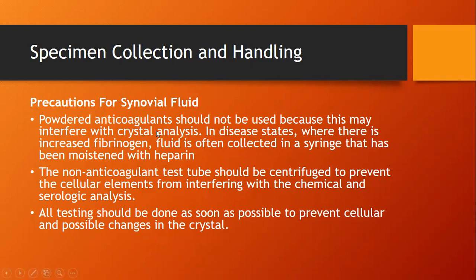Okay, so remember, when we do synovial fluid analysis, there's a parameter where we check for any crystals seen in the fluid. And if we use powdered anticoagulants, chances are you get artifacts that might be mistaken as crystals. Okay? That's why we need to do away with using powdered anticoagulants.